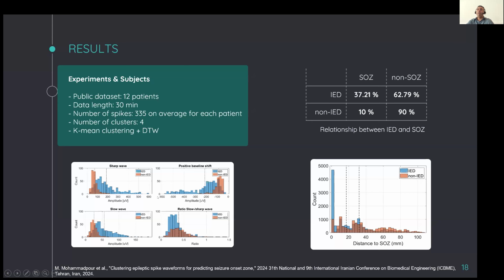In the image below, we see the two groups are different based on this distribution. In the literature, they usually use the biomarker rate to compare algorithms. Here we add another metric to compare how good the detector was.